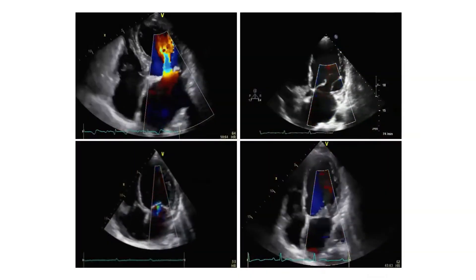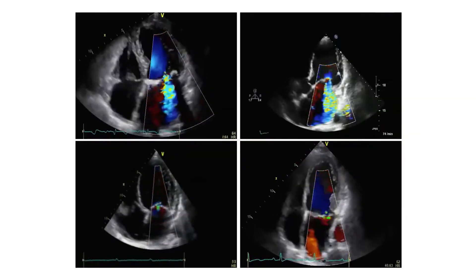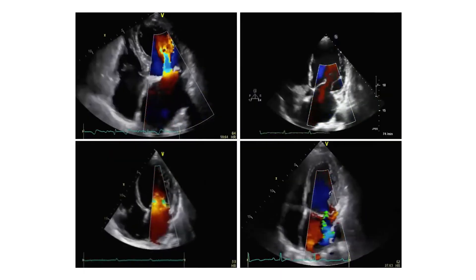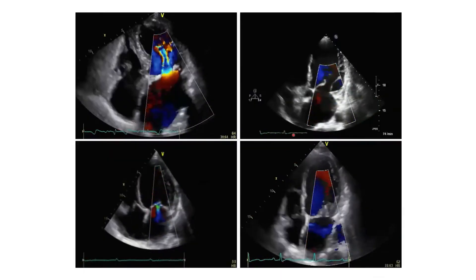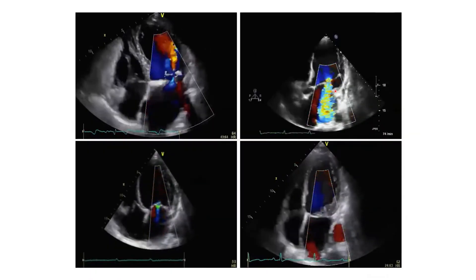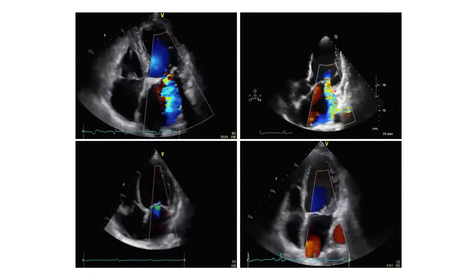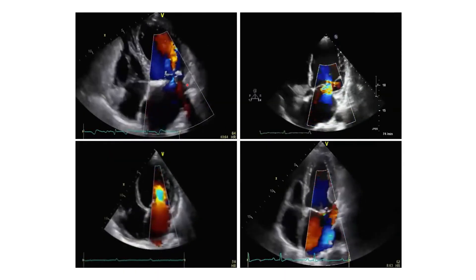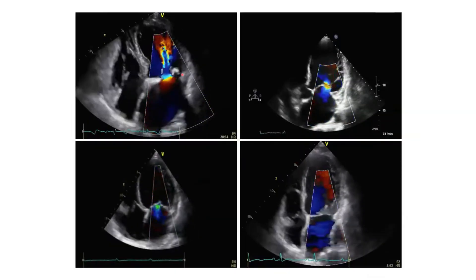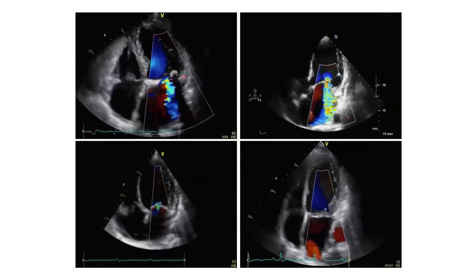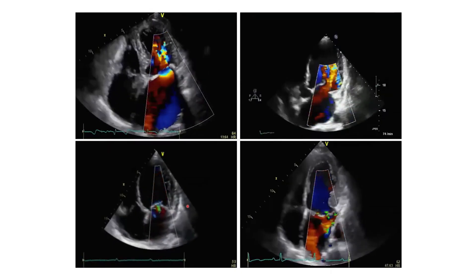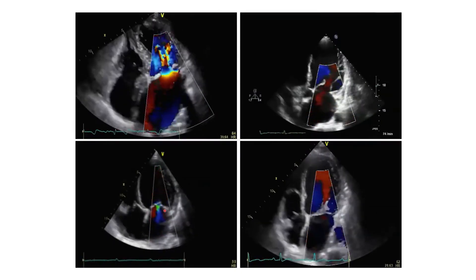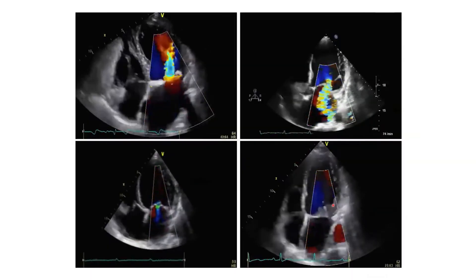Using the concept of a large regurgitant jet and a wide vena contracta, which two echoes show the most hemodynamically significant mitral regurgitation? The answer is the top two, with the worst being on the top right — the widest vena contracta and a mitral regurgitant jet that takes up over 50% of the left atrium. In a close second, there's still a wide vena contracta and a jet taking up less than 50% of the left atrium. The two on the bottom are not hemodynamically significant — a narrow vena contracta and a small lighter-flame mitral regurgitant jet.